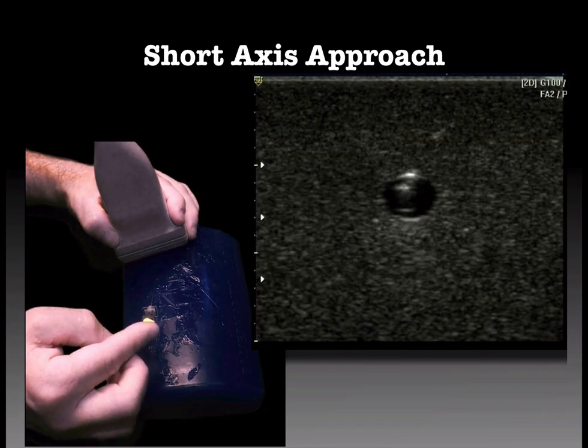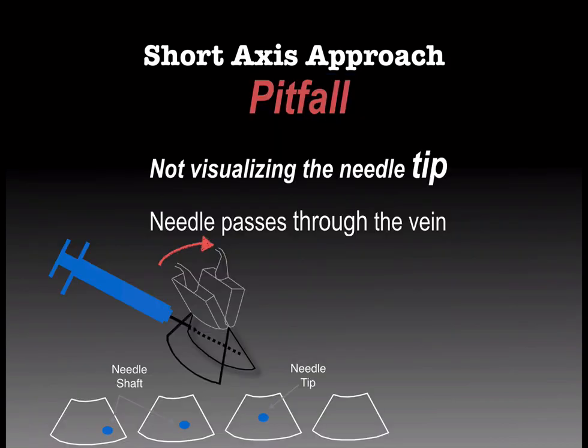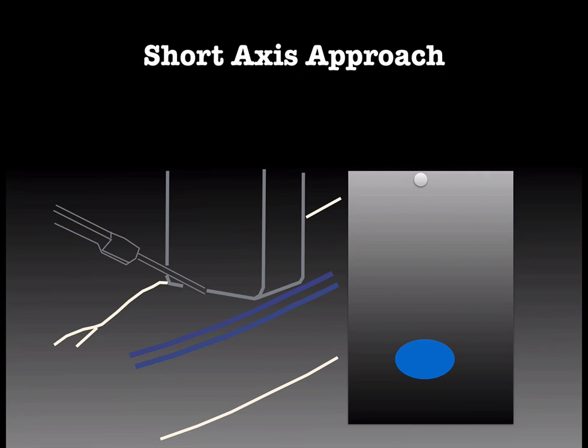And here we have the needle tip sitting in the vein, and we can slide up and back and make sure that we're looking at the needle tip sitting in the middle of the vein. Now, that's how you do it. Just remember that if you don't see the needle tip popping into view, you don't know if you're looking at the needle shaft or the needle tip. We want to make sure we're seeing the needle tip because it's what pops into view. When we see the needle tip, we stop moving the needle into the vein or into the tissue. We stop and move the probe, then needle.